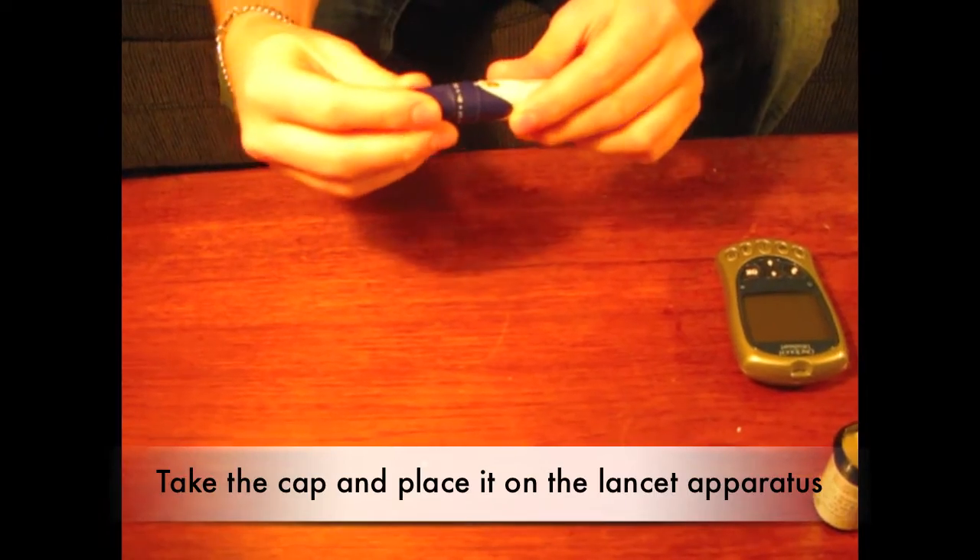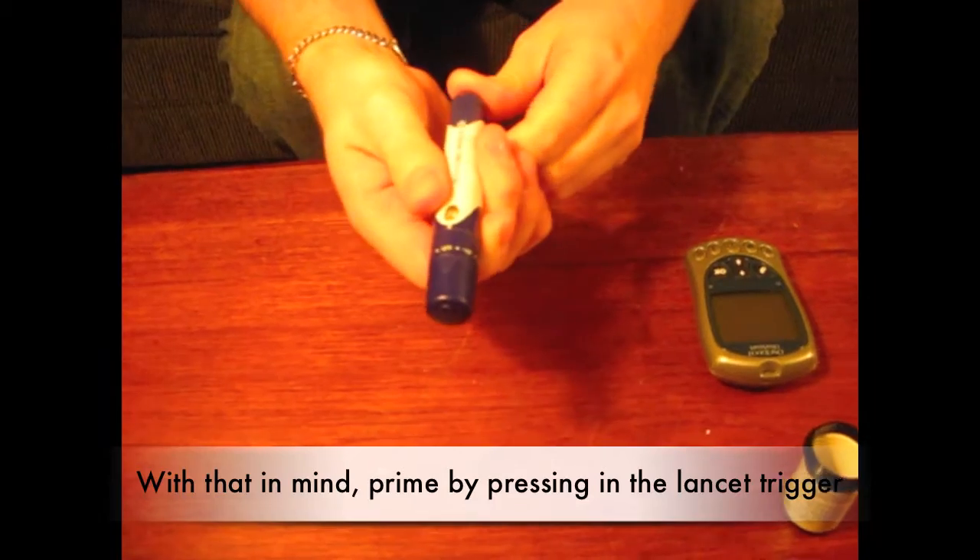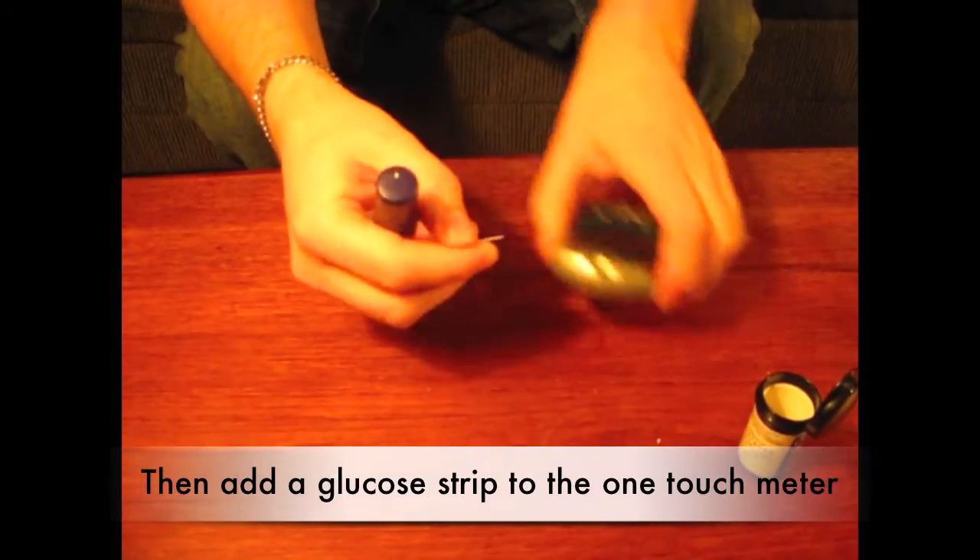Take the cap and place it on the lancet apparatus. Take the device to draw blood for your glucose status. Prime by pressing in the lancet trigger. Then add a glucose strip — there's a one touch.